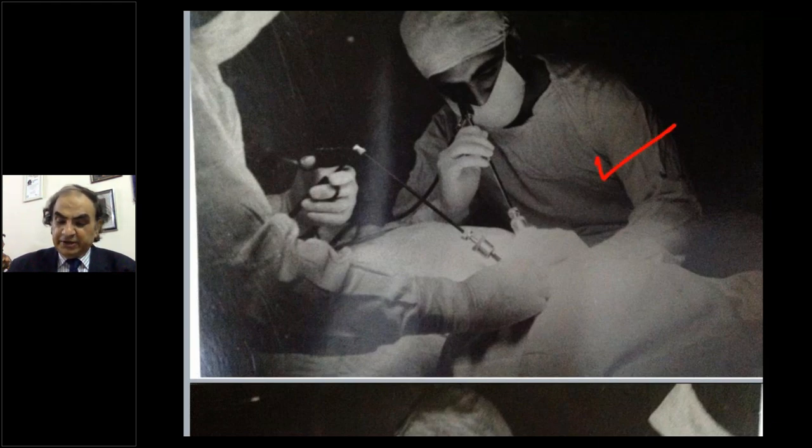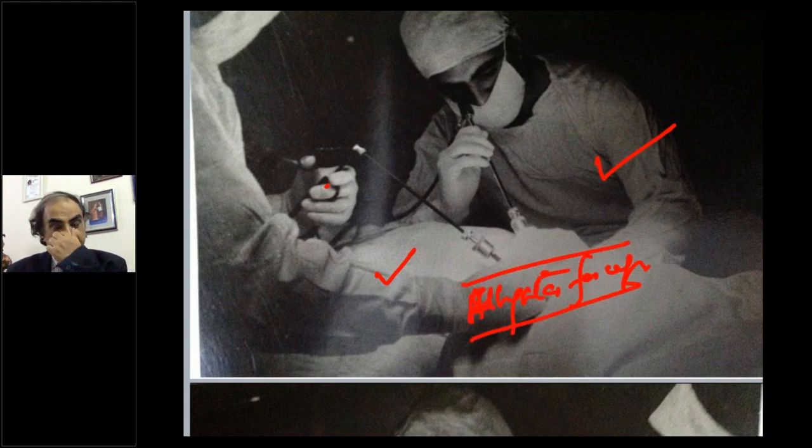And well, this is not to let you know that it changed history for somebody, but that's me, yours truly, way way back, because I got my thesis as diagnostic laparoscopy in malignancies. Now you can see I've used this port to reach where I had to reach, and then my assistant can help me after I fixed it to take a biopsy. This is an old alligator forceps. It's long back, and we had to learn laparoscopy at that time from the gynecologists. We did not do it at all. No surgeon knew it. When I got it as a thesis, I was wondering who was going to teach me how to do it, because the learning was tough. So I learned it from the gynecologists, and gynecologists use it very commonly in their lap ligations, etc. So they're very familiar.